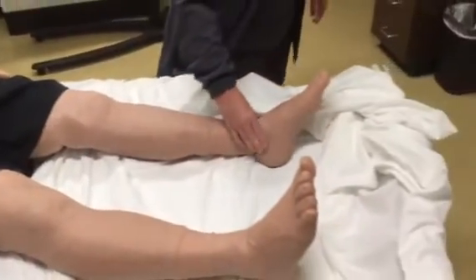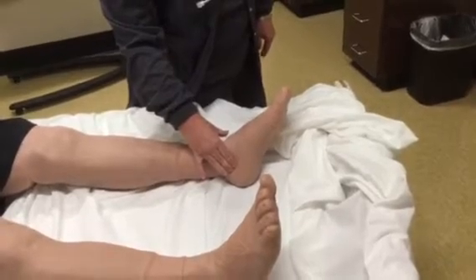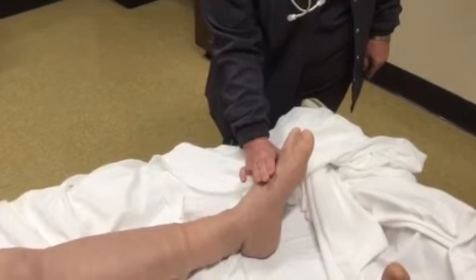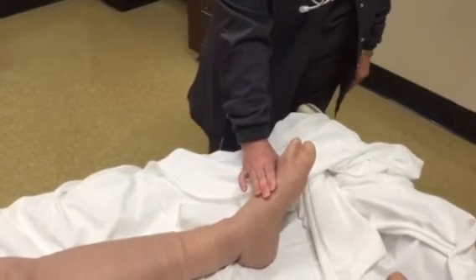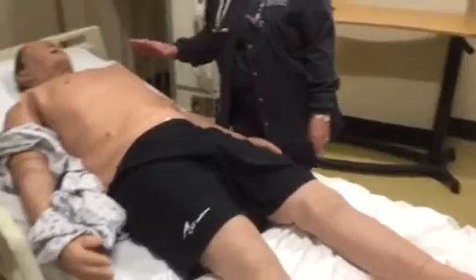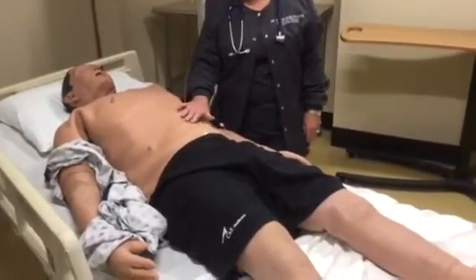Your posterior tibial is just below the ankle bone on the internal side of the foot. And then you have your dorsalis pedis, which the easiest way to find it on these mannequins is to make a letter C with your hand, cup the small toe, and lay your fingers there, and you will be able to find it.